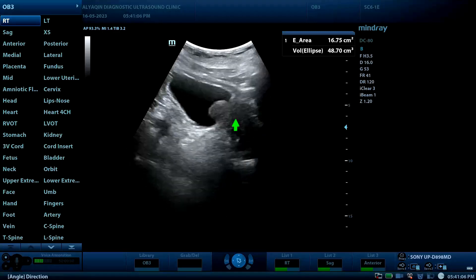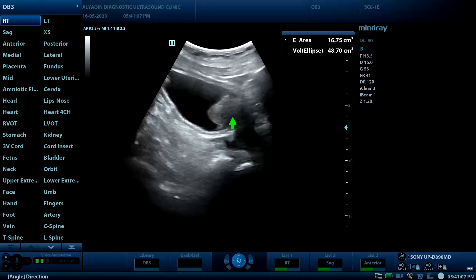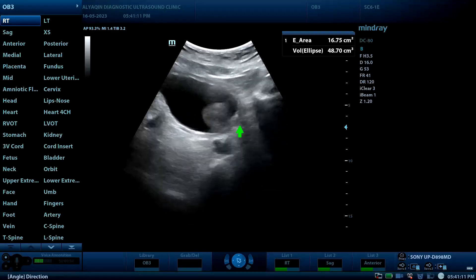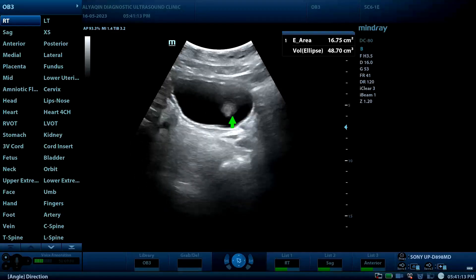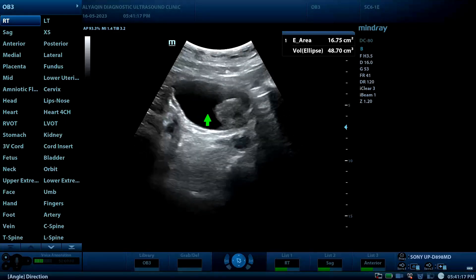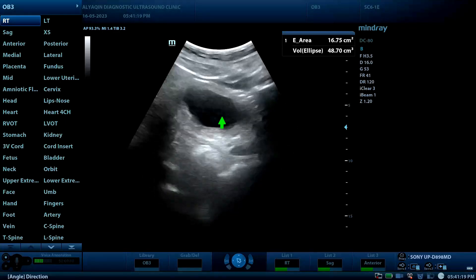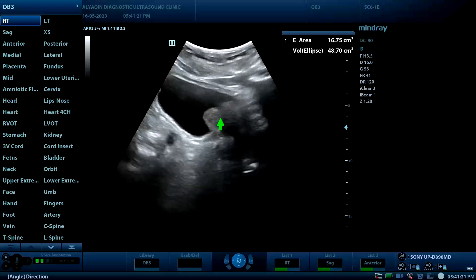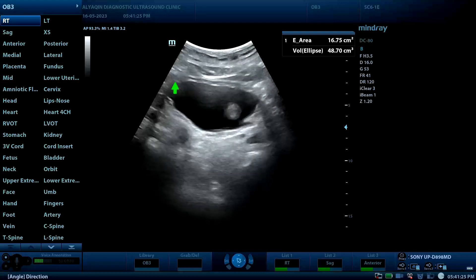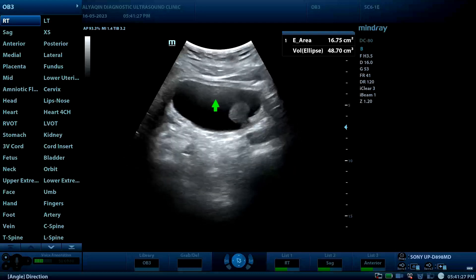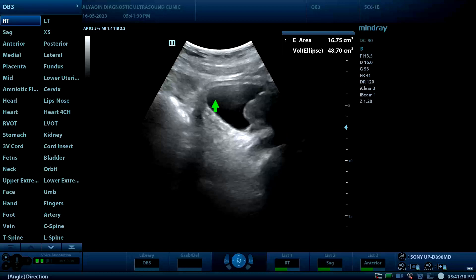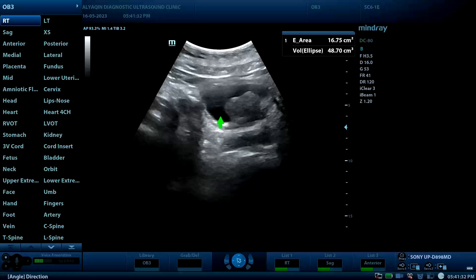Here is the continuation — it is part of the median prostatic lobe, which is very enlarged and causing projection of prostatic tissue toward the urinary bladder cavity. There is no other filling defect or bladder mass identified.